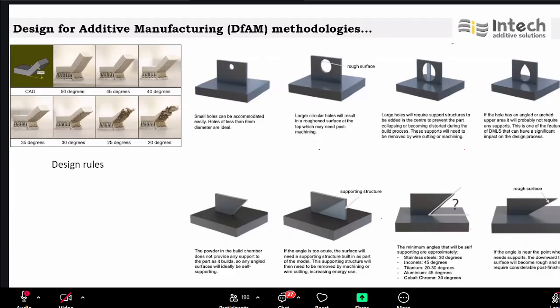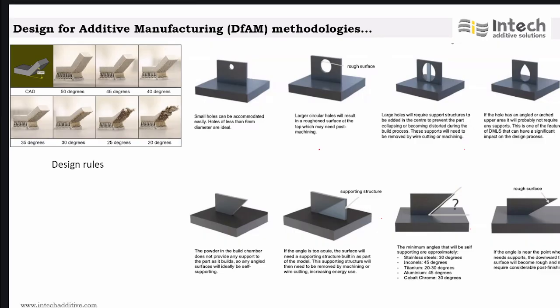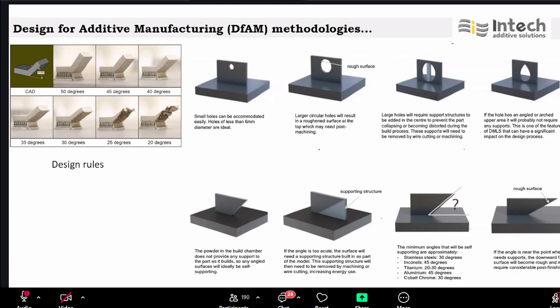Now I am going to take a very simple example, design rules for additive manufacturing. Then later we will go through a complex example. I love to explain that, so don't worry about the number of lines at all. We have a critical overhang angle of 45 degrees.